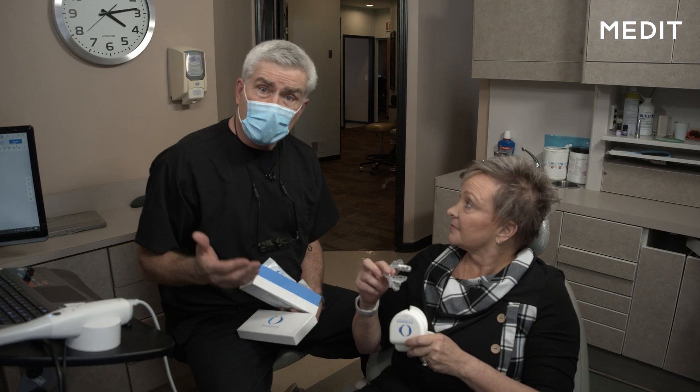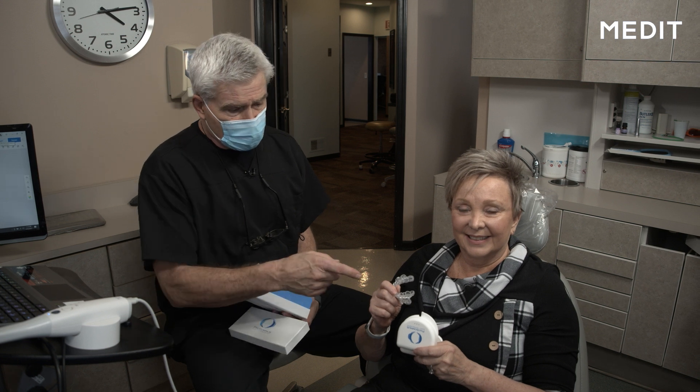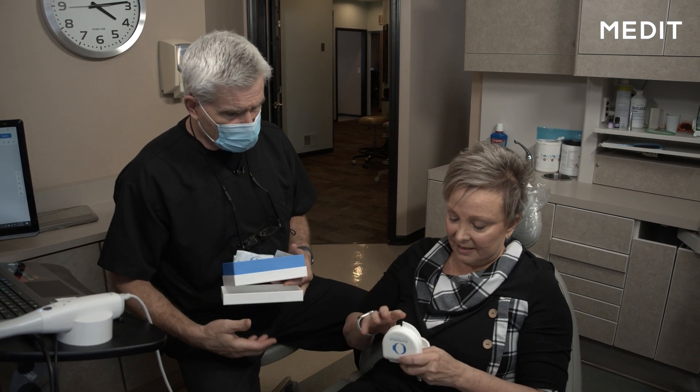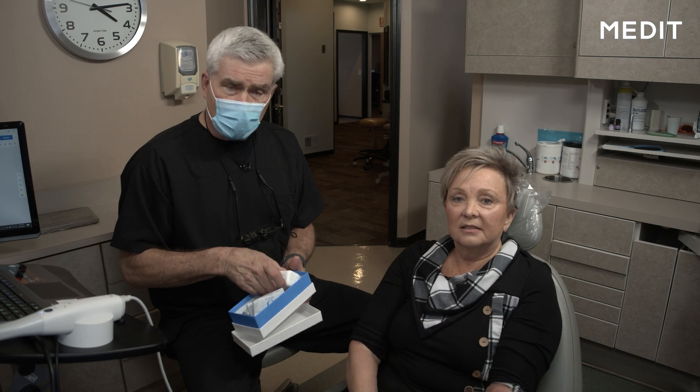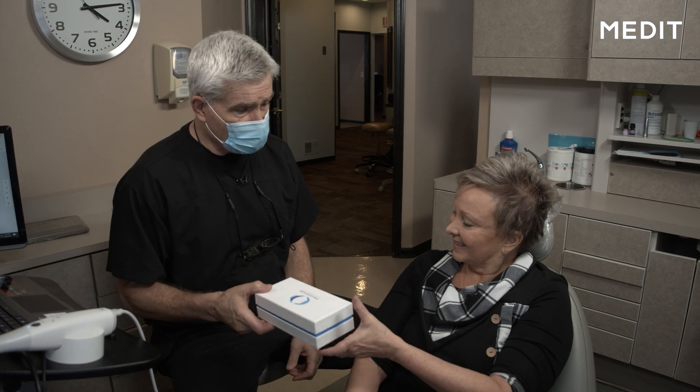So what we've done now is we've gone ahead and delivered Denise's case. She's going to pop those back in. The good news is they dropped right in and fit beautifully. She's got her extra arches, a nice little box from Persomnus, her personal case, and we got those back in pretty quick time. They fit comfortably and everything felt great. Thank you very much.